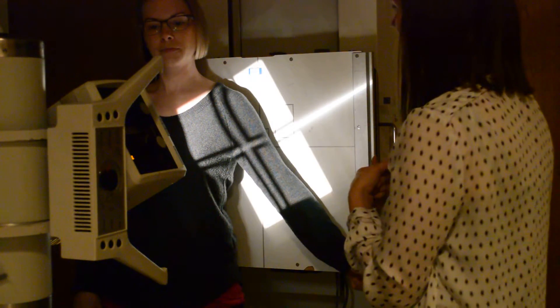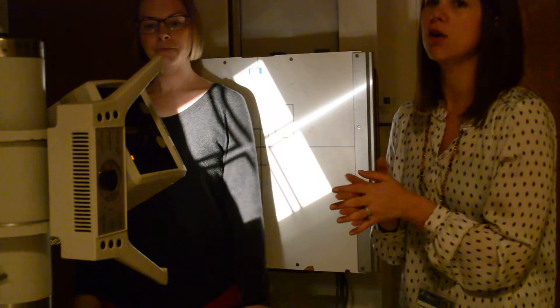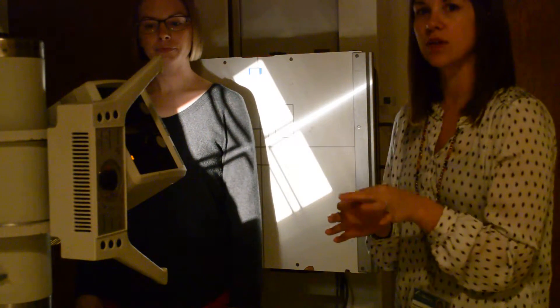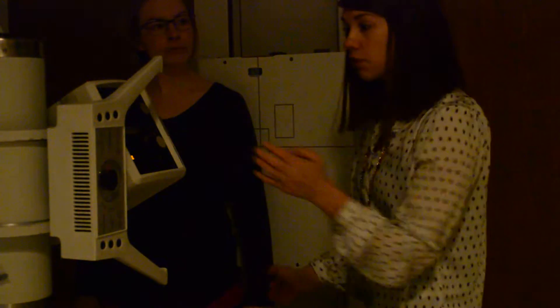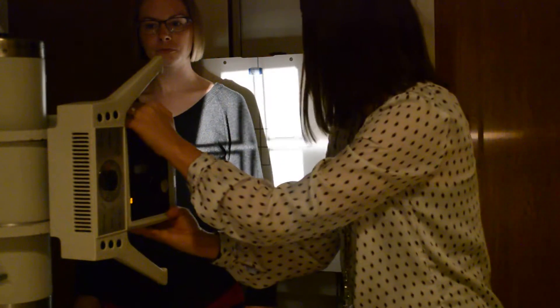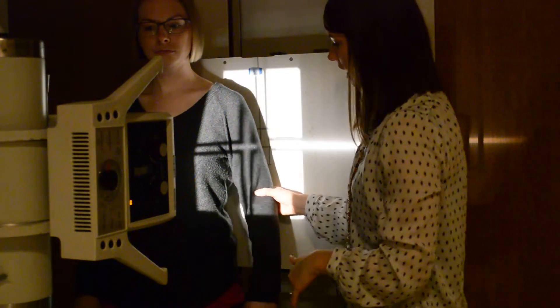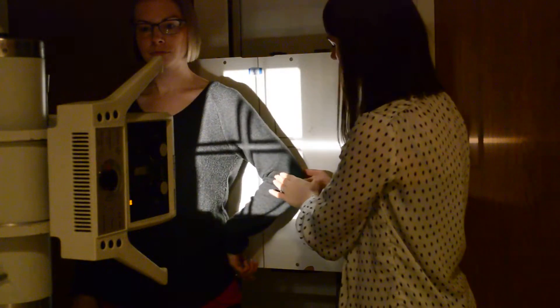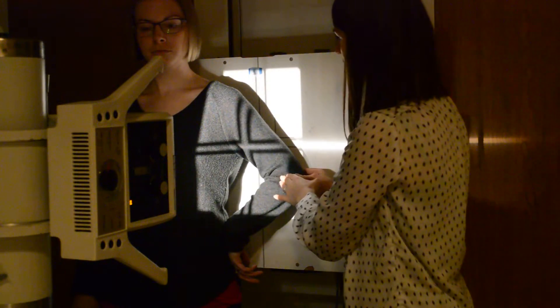From here, we're going to do a lateral humerus. You can do the lateral humerus one of two ways — you can do it AP or PA. PA is going to give you a little bit less OID. I'll show you both ways. If we do AP, I'll have Libby put her hand on her hip. What we're trying to do here is get the epicondyles perpendicular to the IR. That's going to give us our true lateral.